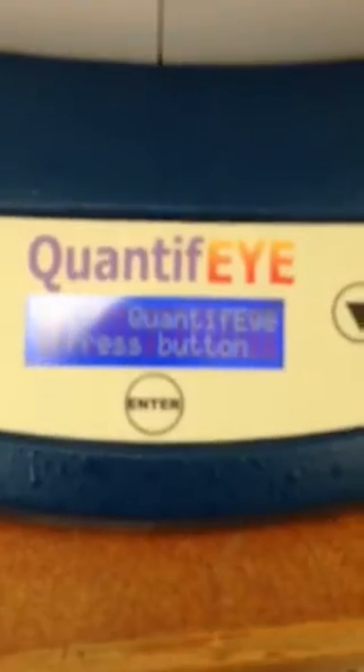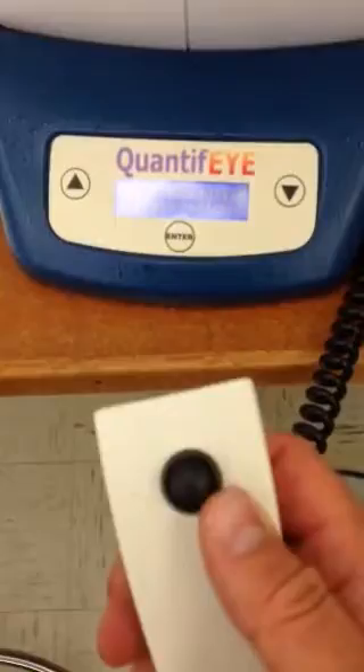First, you want to turn the instrument on using the switch on the back, and you will see here that it says press the button to demonstrate — and they mean the test button for the patient.